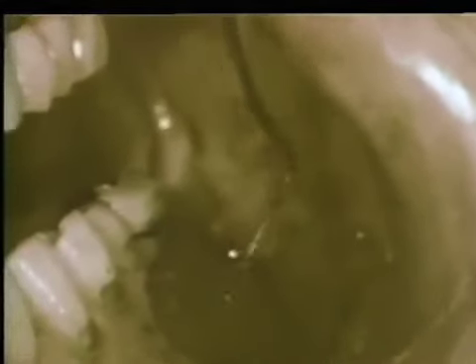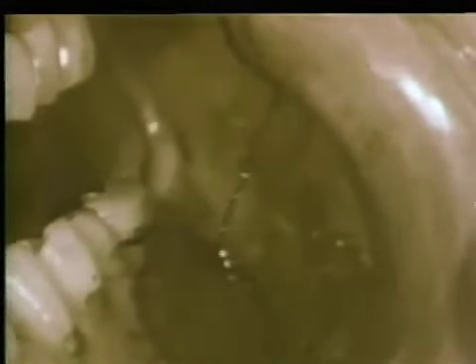This is frequently the location for the origin of buccinator muscle fibers. The loose connective tissue and muscle fibers must be removed from the periosteal bed. Soft tissue nippers are used for this purpose. The removal of this tissue will ensure that the graft itself rests on a flat periosteal bed. The periosteum covering the cortical plate of the alveolar process is not disturbed. This flat, well-prepared bed is free of soft tissue irregularities and is now ready to receive the graft from the donor site.